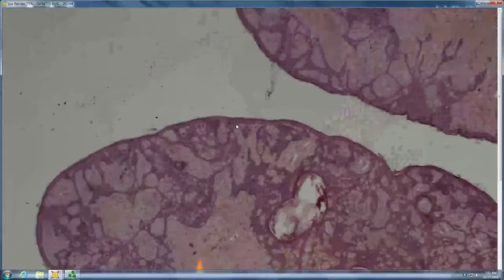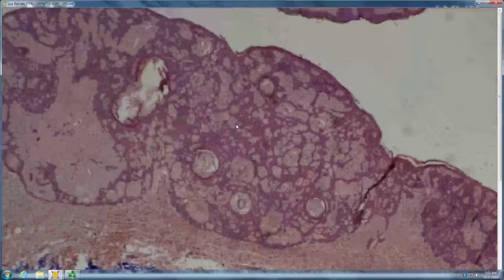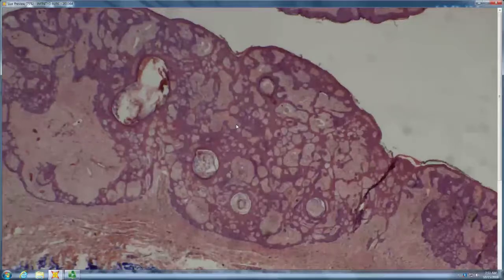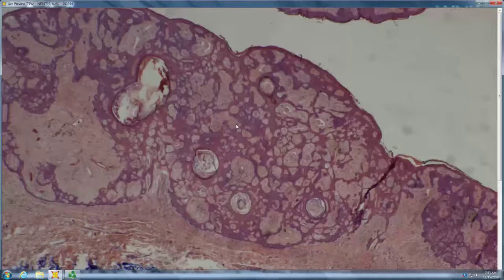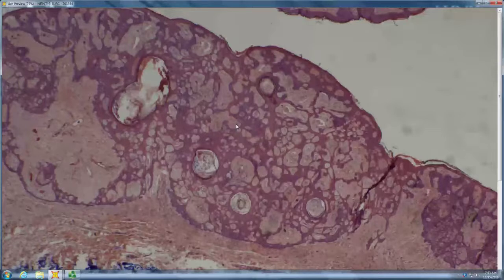Okay. Looks like a Pinkus tumor. Why does it look like a Pinkus tumor? It's like an anastomosing pink strand. That was easy. Yeah. So anastomosing pink strands, blue buds. How does it differ from infundibulocystic BCC? It's kind of more of a radiating pattern. Yeah, those radiate outward from a central follicle. These anastomose. So Pinkus tumor, very good.